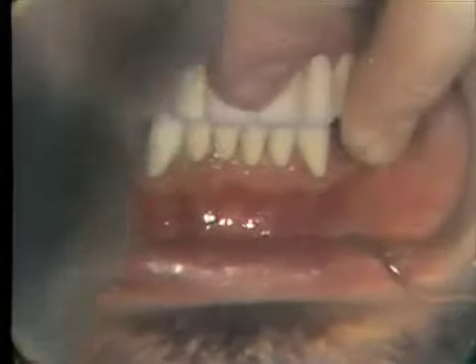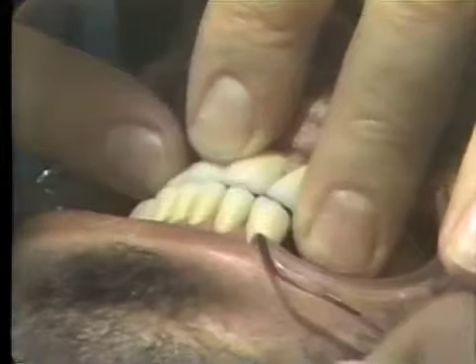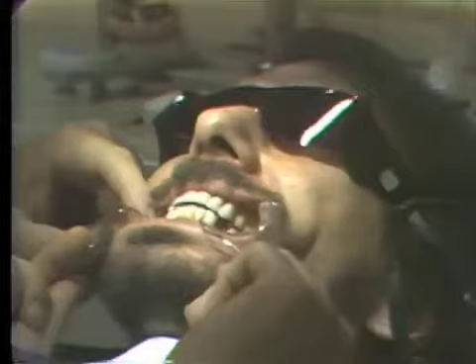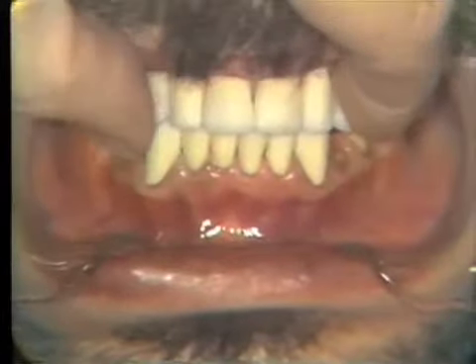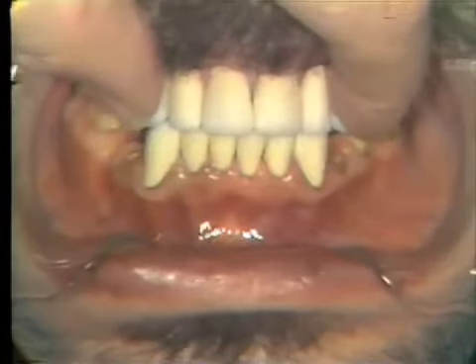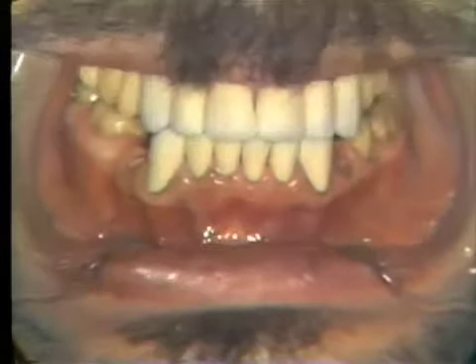Close, please. Come out on your front teeth. Now we're picking up more of the rest of the anterior teeth. We'd go ahead and make the final subtle adjustments in our functional analysis. Close again. In our lateral excursions, we'd like the canines to contact only. Rub to this side, please. Nice, smooth movement. As they move into the working and balancing movement, move the other side, please. Now out on your front teeth, and then have as many teeth in contact as we can in the protrusive movement.